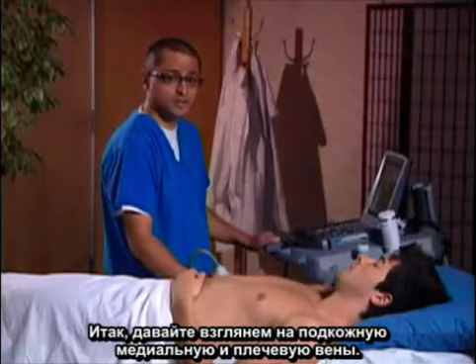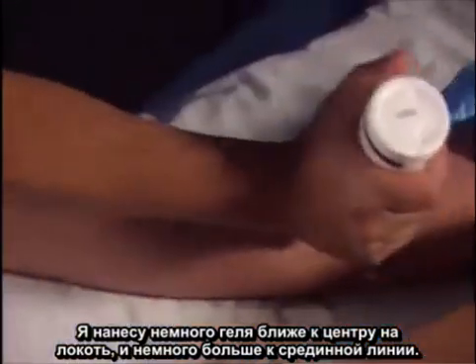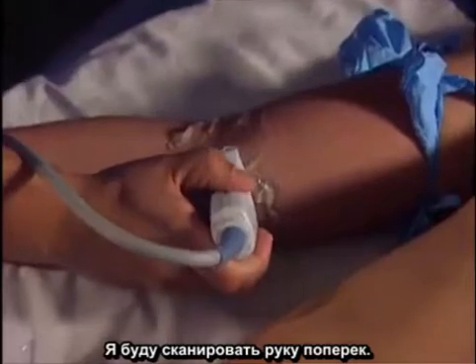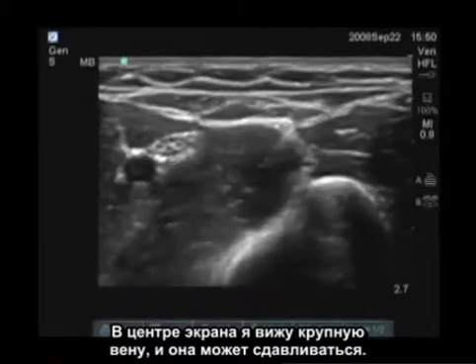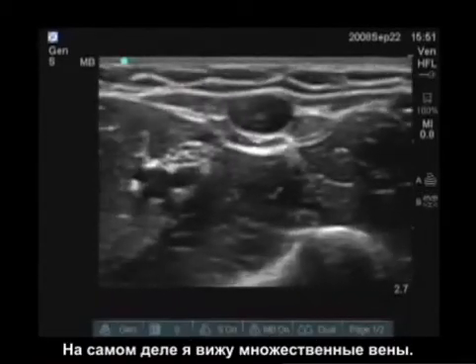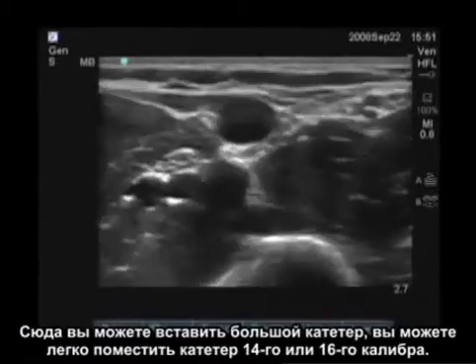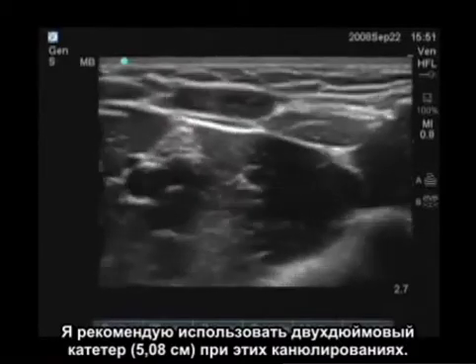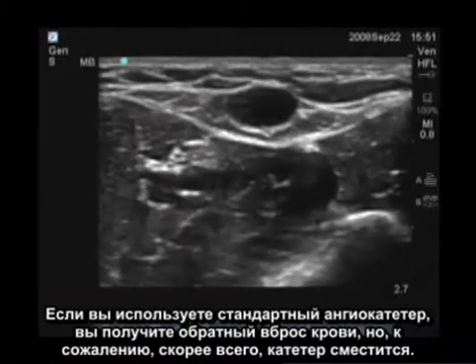Let's now take a look at the brachial and basilic veins. I'm going to put a little more gel, a little more medial of the elbow and a little more proximal. Scanning transversely across the arm, I see a large collapsible vein in the center of the screen — in fact, I see multiple veins. You can place a pretty large catheter here, easily a 14 or 16 gauge. I recommend using a two-inch catheter for all of these cannulations. If you use a standard angio catheter, you will get a flashback, but most likely the catheter will dislodge.